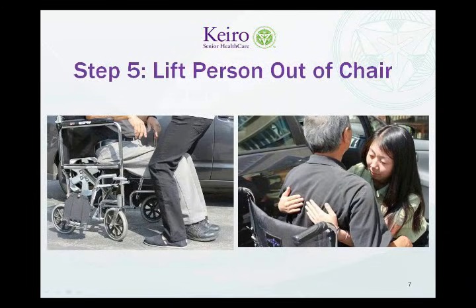Step 5. Let the care recipient know that you are going to start the transfer. Place your legs apart with the care recipient's legs together in between yours. Get as close to them as possible to avoid arching your back. Place your arms underneath the care recipient's armpits and lay your hands flat against their back. Be sure that your knees are bent and that your back is straight to avoid injury. Lift using both your legs and use your arms to bring the care recipient to a standing position.